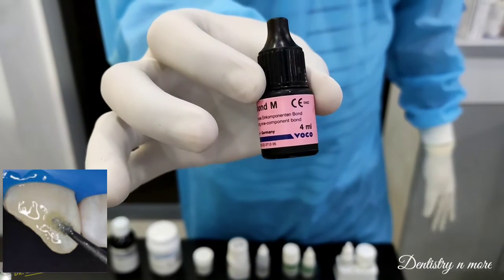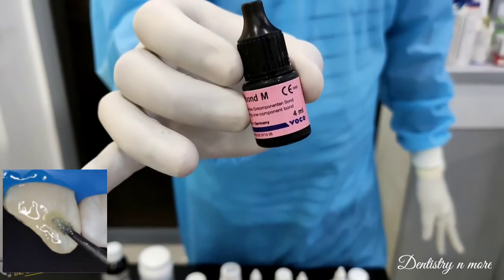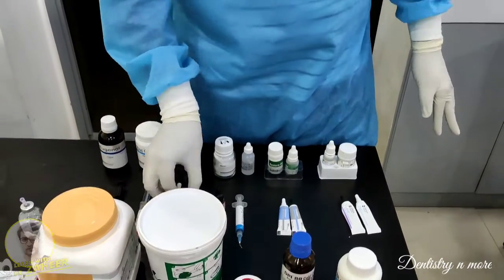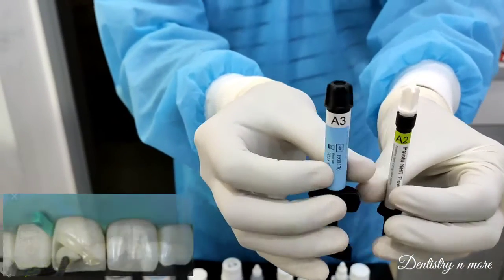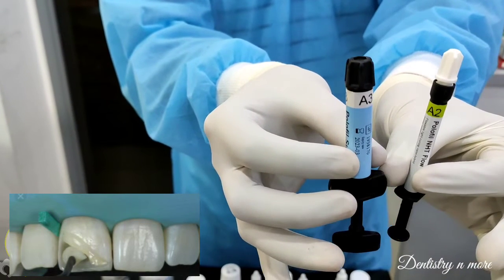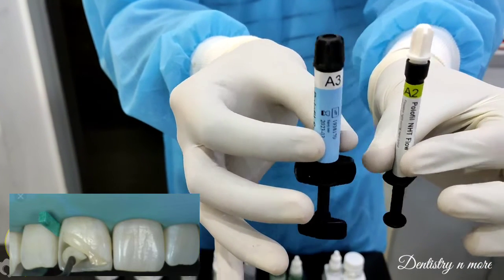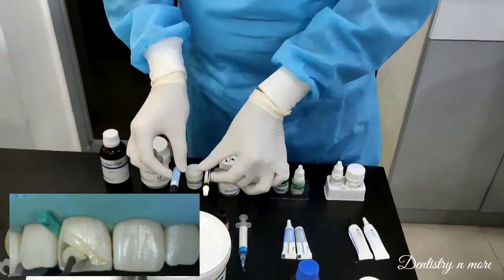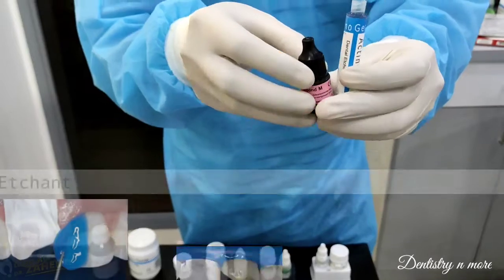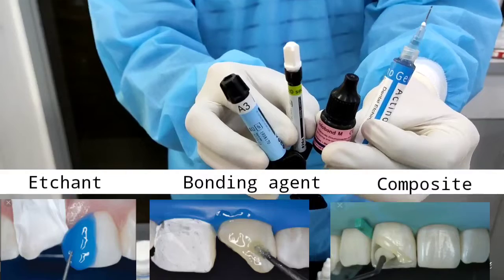Once the etchant is applied and micro-porosities are created, we clean it off and make the surface very dry, then apply the bonding agent. This bonding agent helps to bond the composite material to the tooth. Depending on the patient's tooth shade, we can select the appropriate shade. A composite filling requires three materials: the etchant, the bonding agent, and the composite filling material.